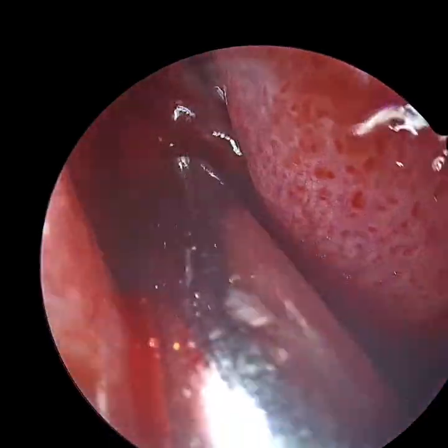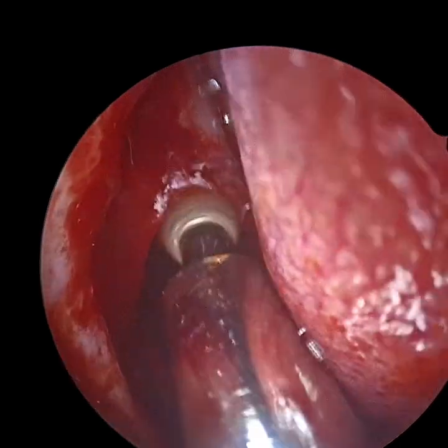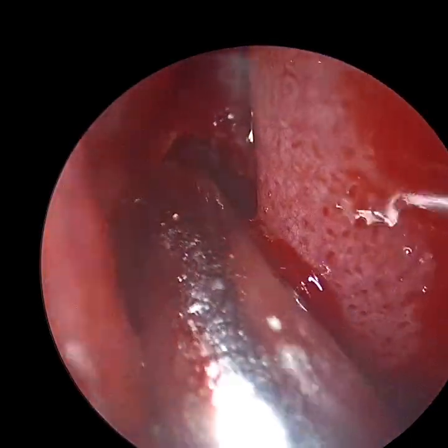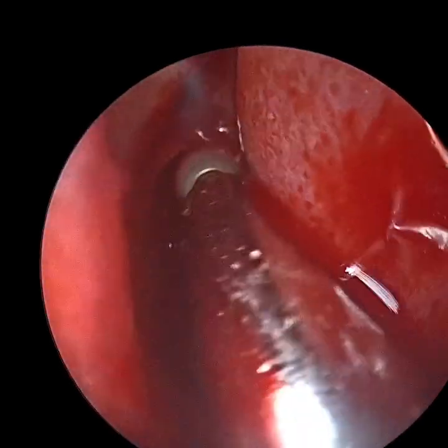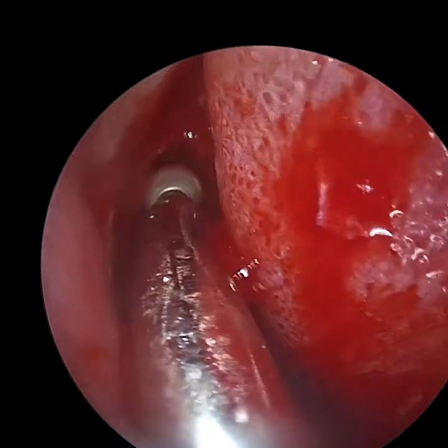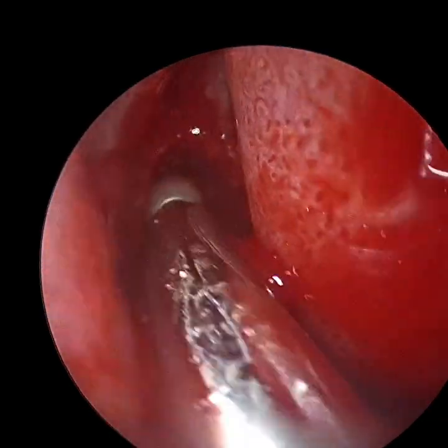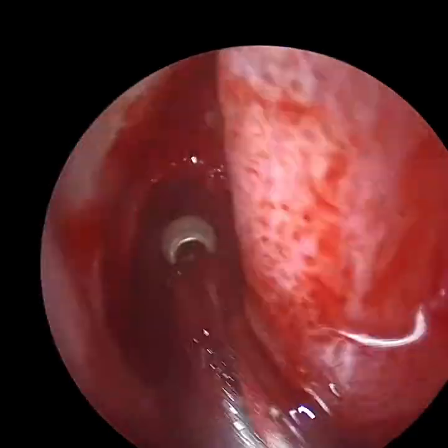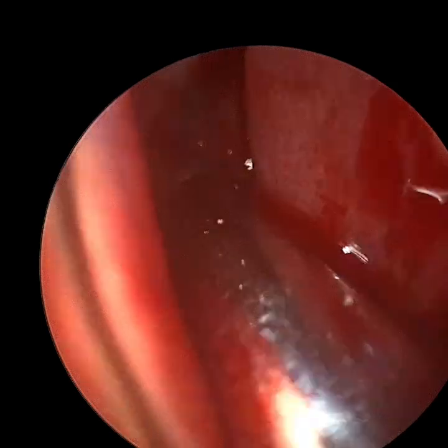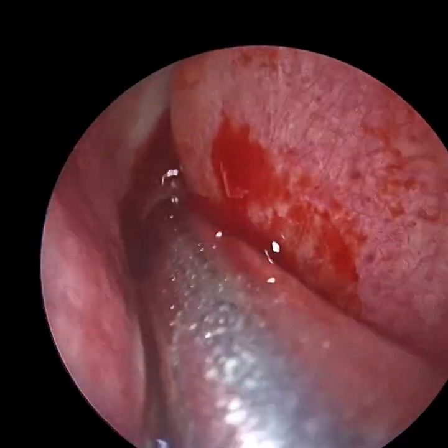So hello friends, this is a patient of transaxillary drilling of frontal nasal process of maxilla for difficult frontal sinus, where the nasofrontal beak is very thick and the frontal sinus was very difficult to approach, and also the patient was having high IgE levels with aspirin sensitivity. So in this sort of patients where you have heavy mucosal disease and on top of it the anatomy of the frontal sinus is difficult, which is covered with the nasofrontal beak.